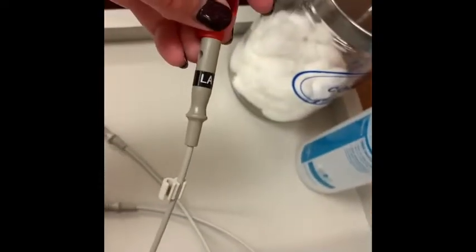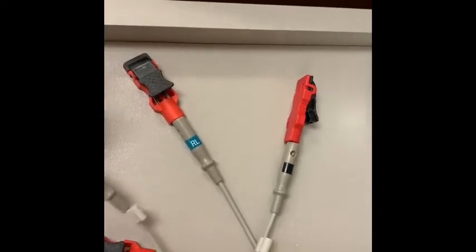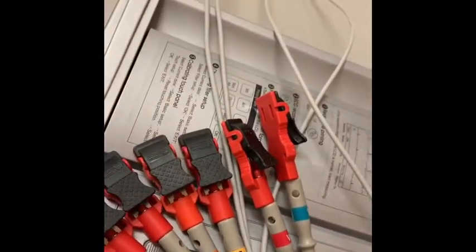These are our electrodes as we had talked about in the lecture. They actually do have the label of where they go. This one says LA which is left arm. You have RL which is right leg. You have RA which is right arm. LL is left leg. And then we've got all of the V for the chest leads.